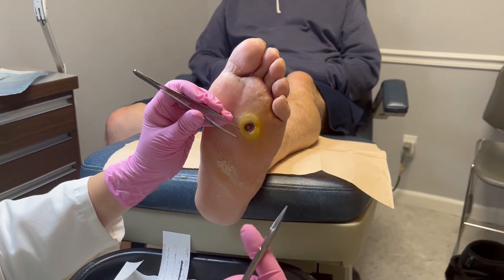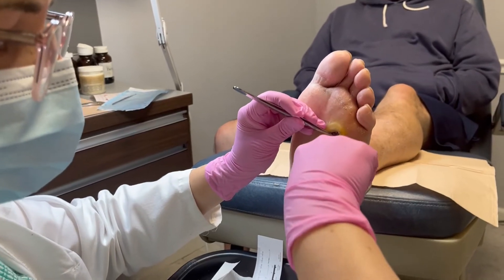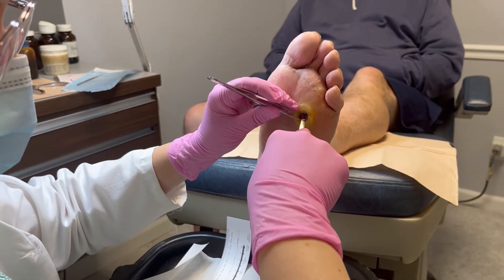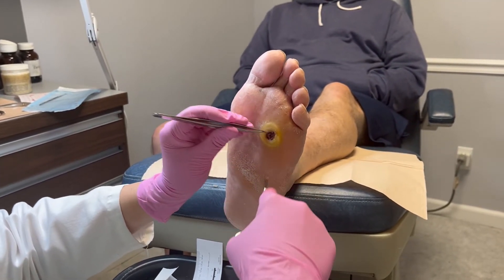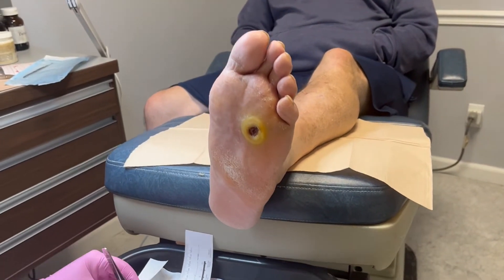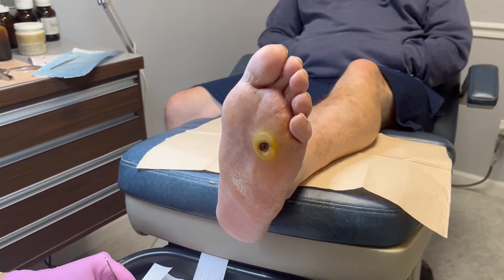We're taking a video of this patient who has a diabetic foot ulcer. He also has a history of Charcot neuroarthropathy, which is specific to patients who have neuropathy — in his case it is from diabetes.